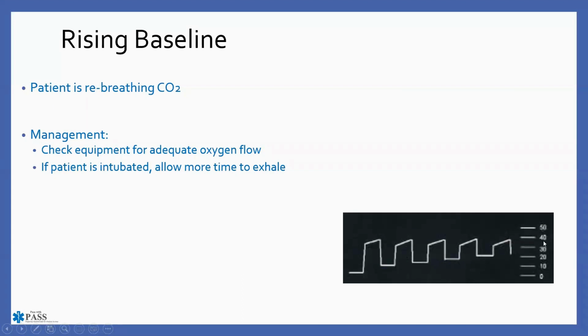This would be the situation where, with like an EasyCap, you're noticing that the EasyCap, or if you're ventilating with the inappropriate sized EasyCap, this is what the result would basically look like. All right, management here, you're going to check equipment for adequate oxygen flow. Make sure that you're not out of oxygen. Otherwise, they are going to be rebreathing their CO2. If the patient is intubated, you need to allow them more time to exhale. So again, back to those of you that have transport ventilators, if you have the ability to manipulate I:E ratios, this would be a situation where you would want them to have more time to exhale.